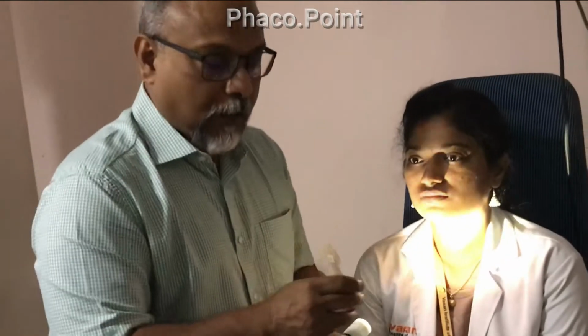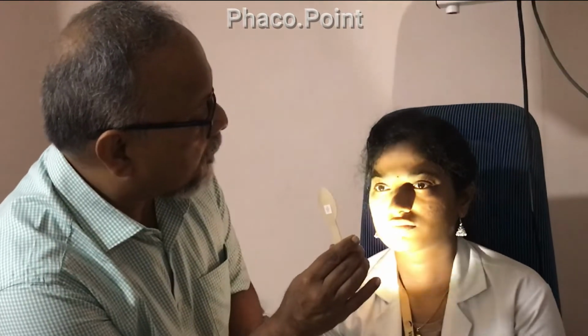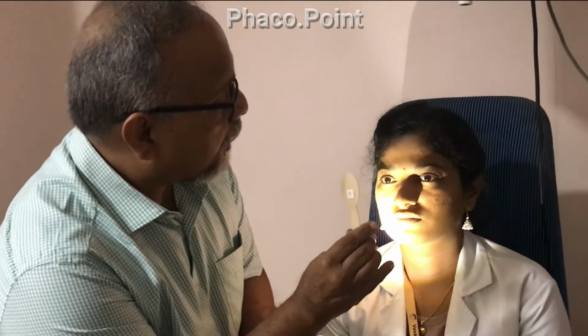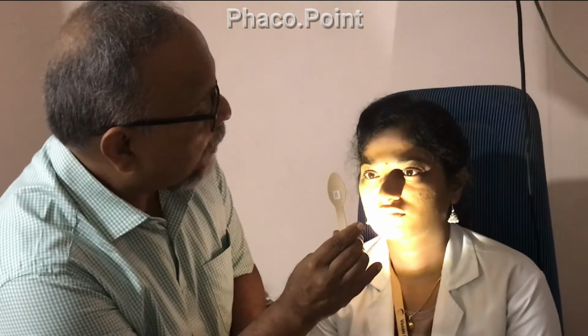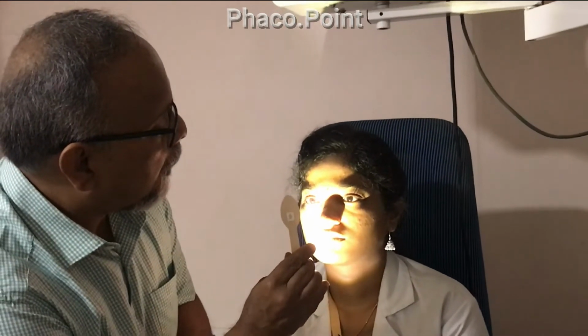So what you do is you keep the target just below the patient's visual line, but make the patient look at a distant target. You use this torchlight to illuminate both the pupils. Now look straight. Now look at the target. Look straight. Look at the target. So when she looks at the target, I can see that both the pupils are constricting, and this is the way you check the near light reflex.